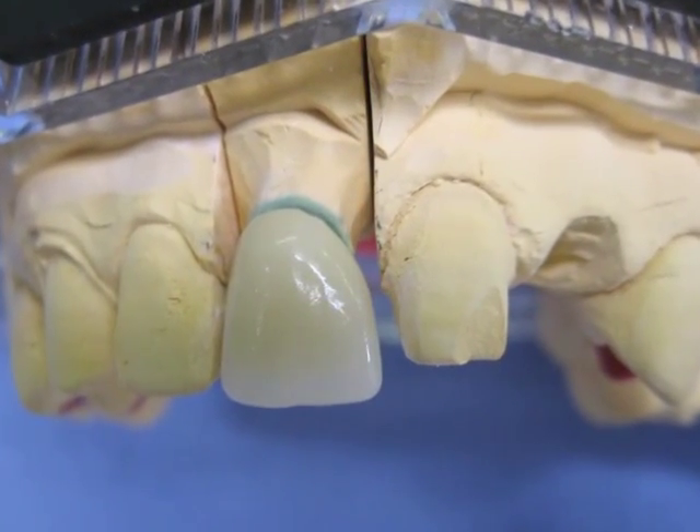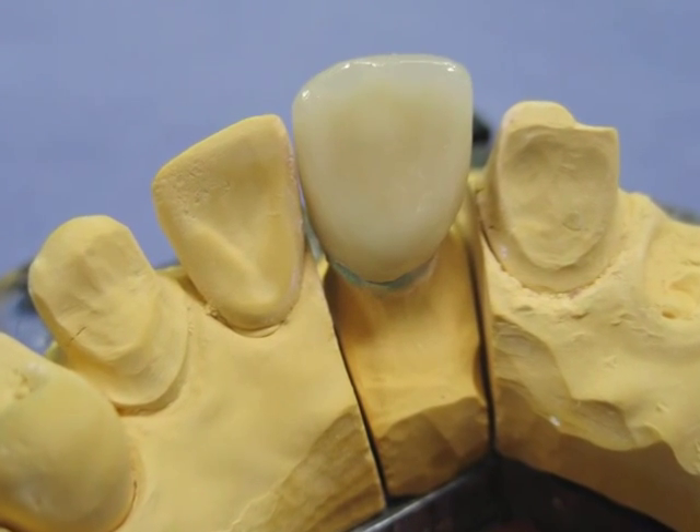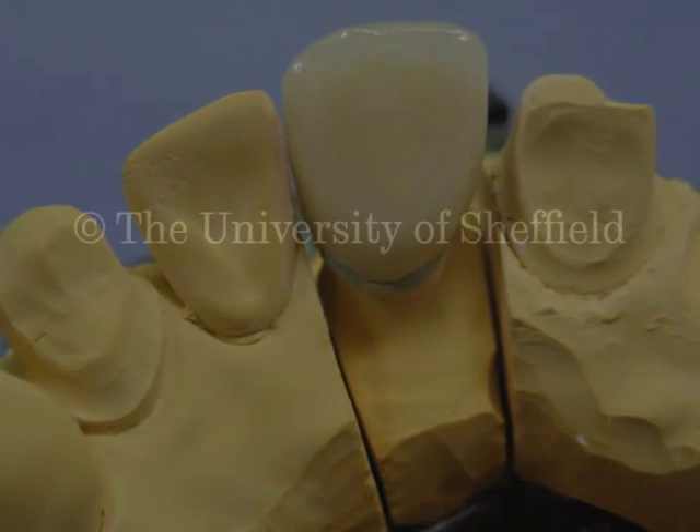That's it then — out it comes from the furnace, all nicely finished off. A little bit of character on the incisal, as you can see, not too much. And that's the lot. Job done. Excellent, thank you.